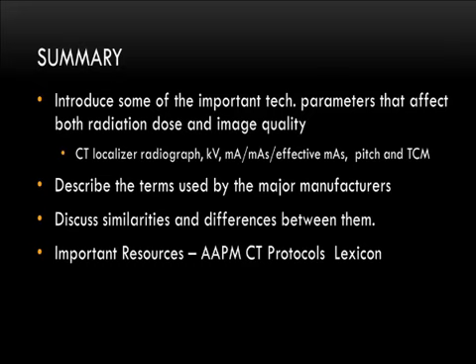The instantaneous mA is limited by the generator, right? So sometimes what people will do for strategies is, I showed you that tube current function going up, in that case up to 500 mA and clipping there. In some systems you can go much higher than that, but it may be instantaneously clipped and there may be ways around that. In other words, by, for example, slowing down the rotation time or decreasing the pitch. Those are also things that can help bring the mA down. But does that answer your question?